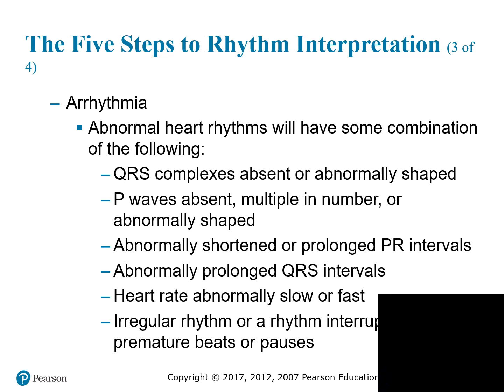You can also have an abnormally short or prolonged PR interval, meaning your PR interval is right up next to the QRS, there's really no space, like your P is sitting right on top of your QRS, or your P is a long ways away from your QRS. It's like a faulty starter. You turn the key and there's dead silence, and then all of a sudden you get a vroom. That's what we describe as a prolonged PR interval.